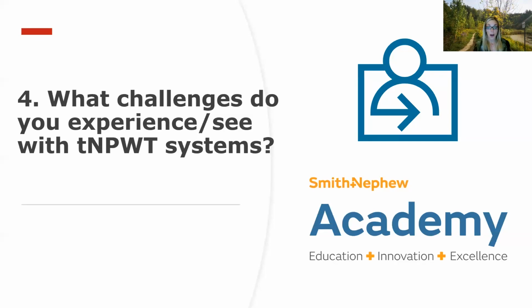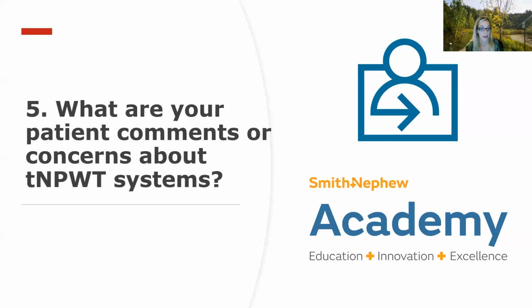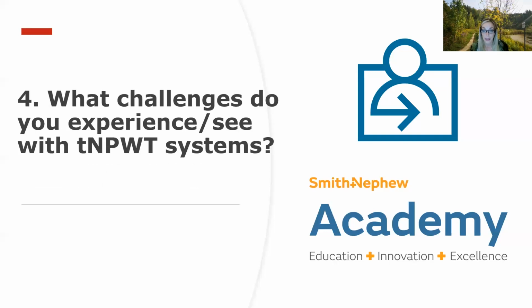Okay, so we saw a bunch of those things, and I look forward to showing some of my case studies on how we have addressed some of those things. Okay, unit is very heavy, and again, leakage is a big thing and difficult to seal.